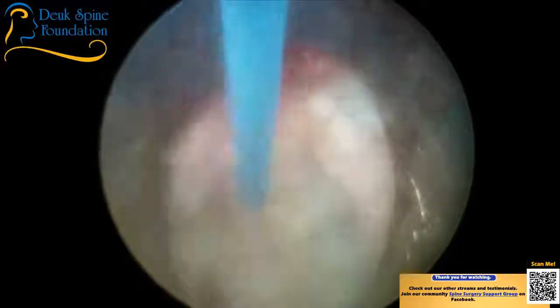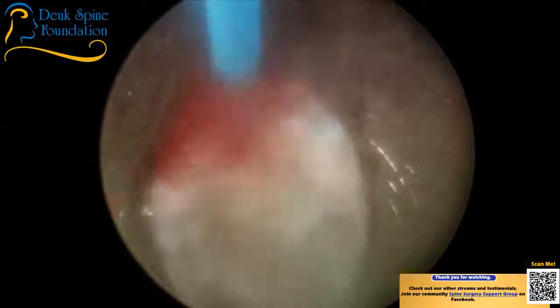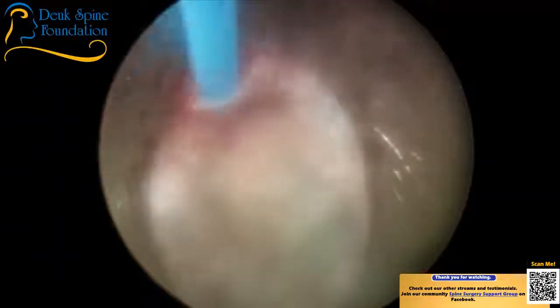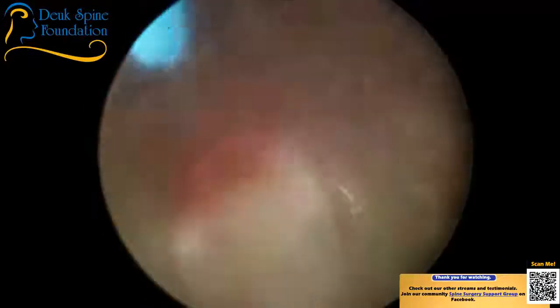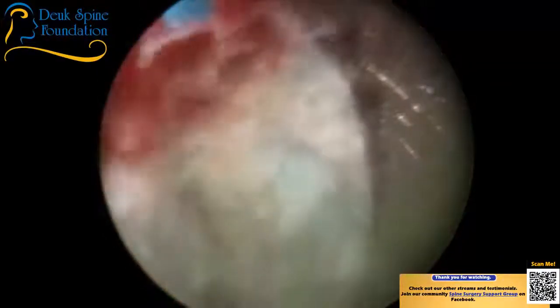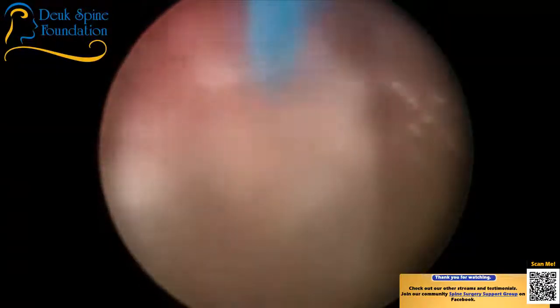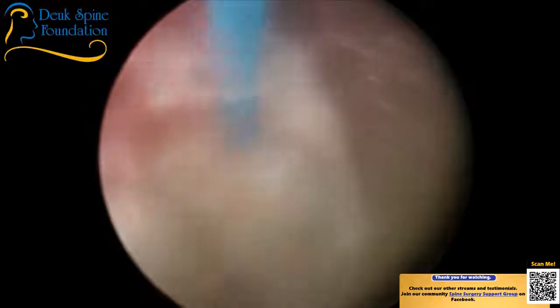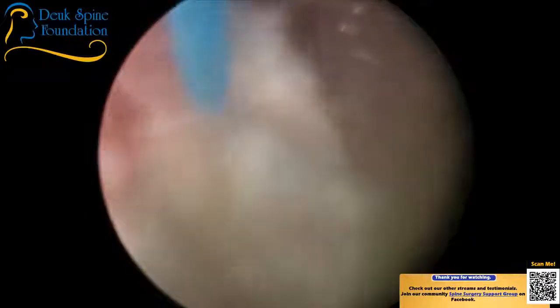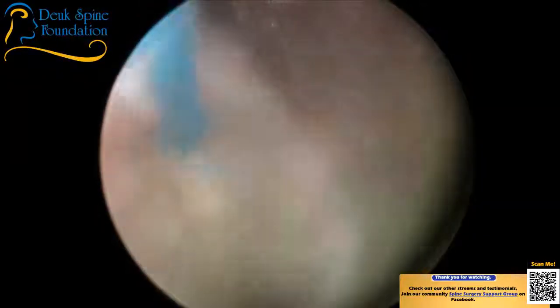Almost done here. We have a little bit of epidural bleeding. I'm not concerned about it, but it is making your visibility more difficult. So it makes it harder for you to see what I'm doing. I still know what I'm doing. I don't need a perfectly crystal clear view to do what I need to do. But unfortunately for you, you're going to have a hard time seeing what I'm doing.